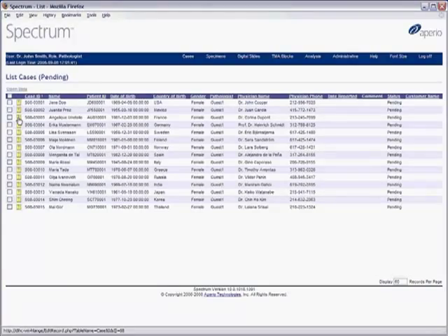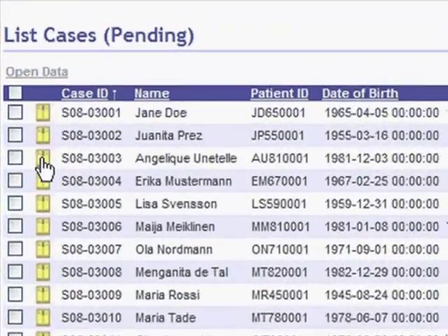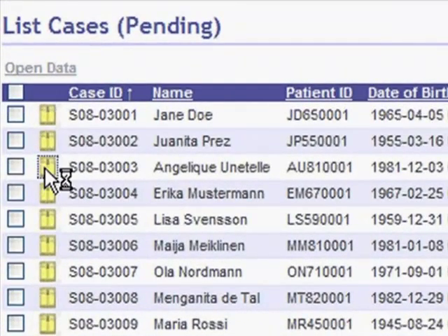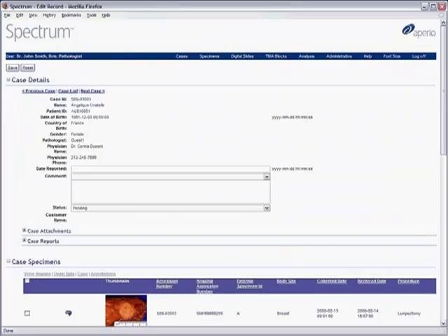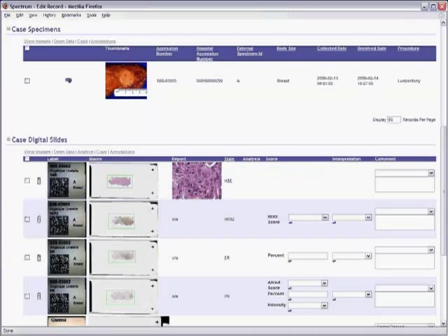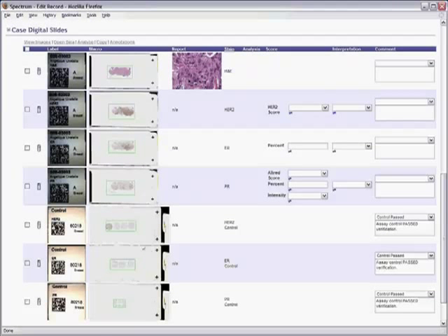Go through your work lists of pending cases. When you open a case, all case, specimen, and slide information, including gross images and controls, are conveniently at your fingertips.